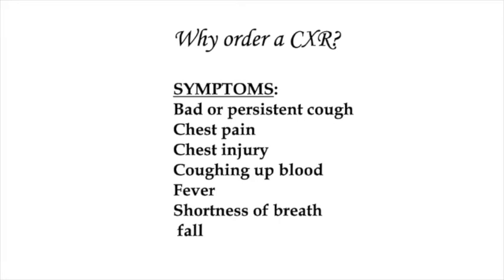Now, why would you order an X-ray? You order an X-ray because of the symptoms. Maybe it's a persistent cough, chest pain, chest injury, coughing up blood, fever, shortness of breath, or a fall, and many more.